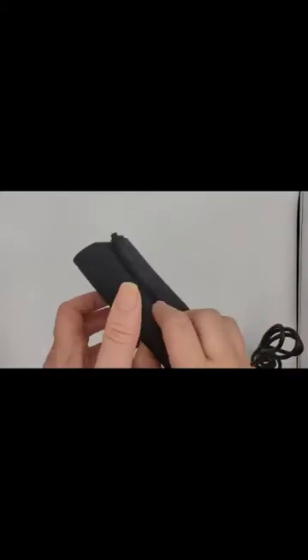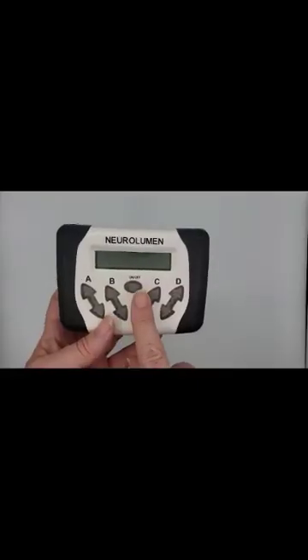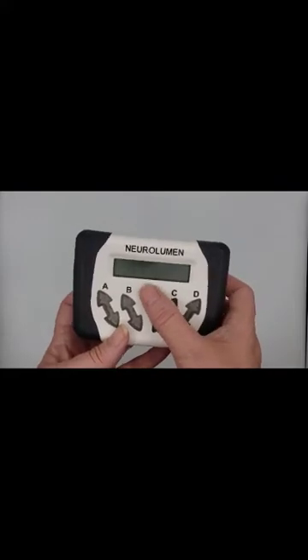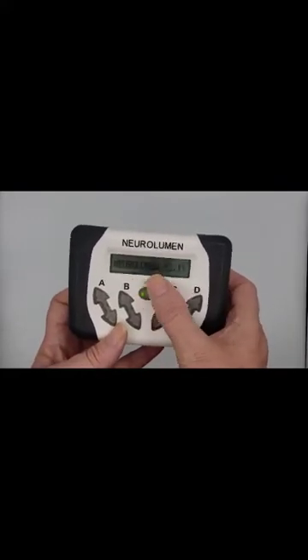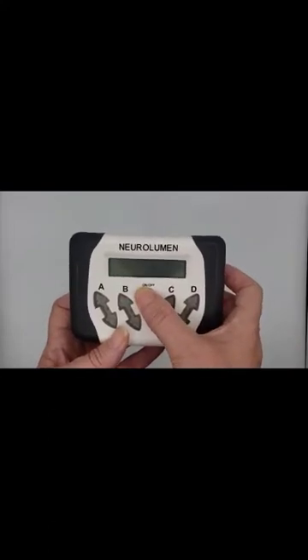You also receive tails that can be attached to your treatment pad to secure to your body with Velcro on one end. These can be removed and are interchangeable, so use what's most comfortable to you. Please be careful when removing your tails from the treatment pad. To turn on the unit, you will press the on-off button in the middle. You will see the screen turn on and the display zeros under each port. You can also turn off your unit by pressing the same button.